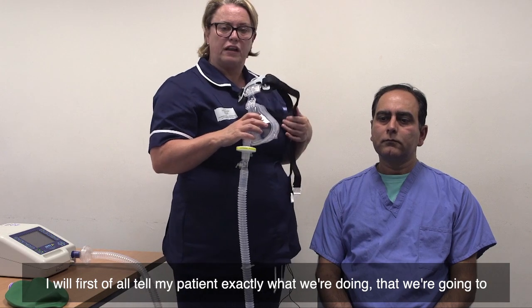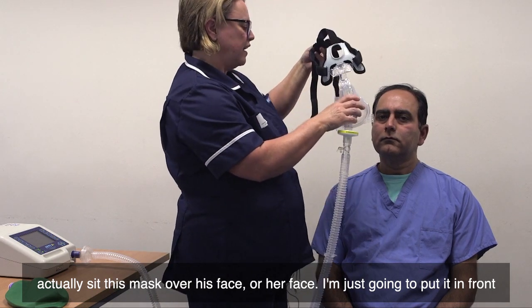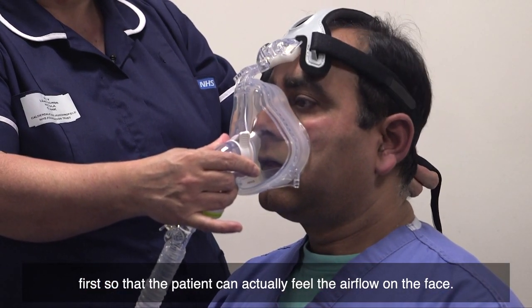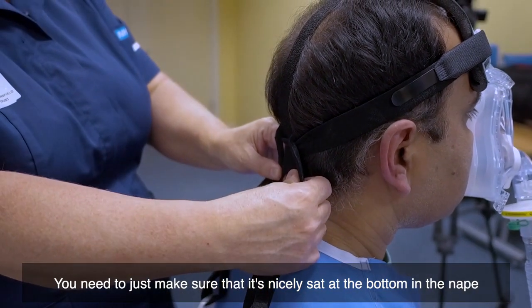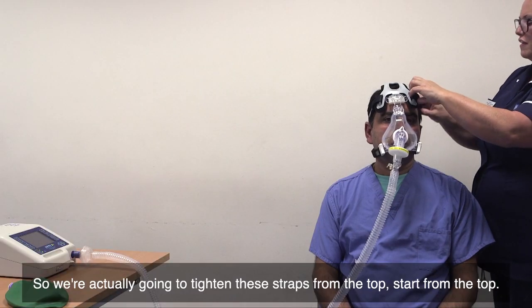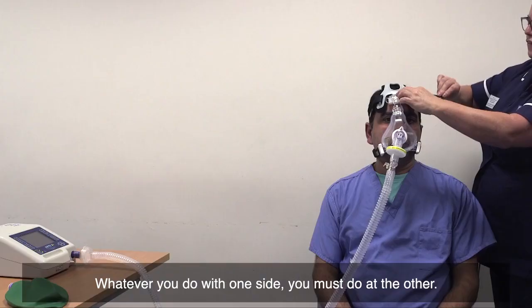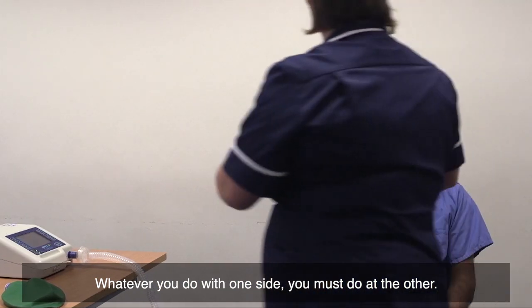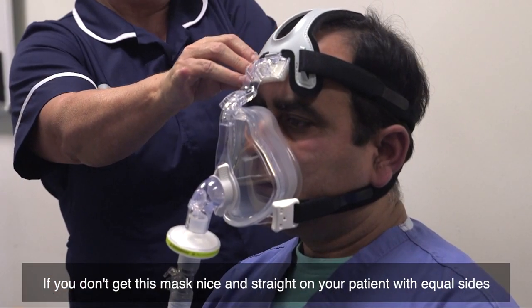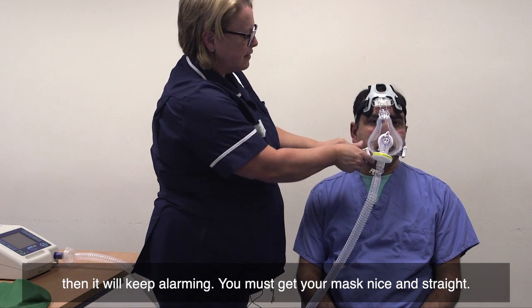I'll first tell my patient exactly what we're doing — that we're going to sit this mask over the face. I'm just going to put it in front first so that the patient can feel the airflow on the face. Make sure it's sat nicely at the bottom in the nape of the neck. We're going to tighten these straps from the top — start from the top, and whatever you do on one side, you must do on the other. If you don't get the mask nice and straight with equal sides, it will keep alarming.